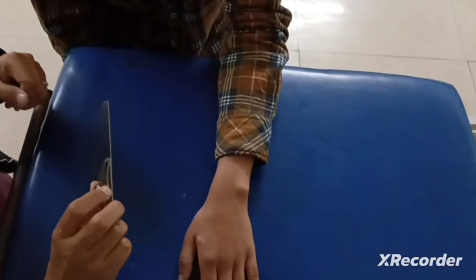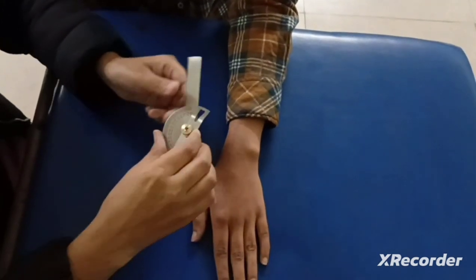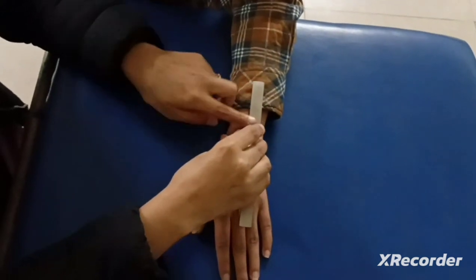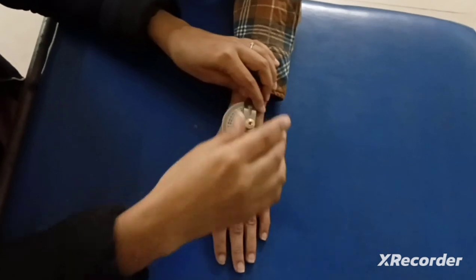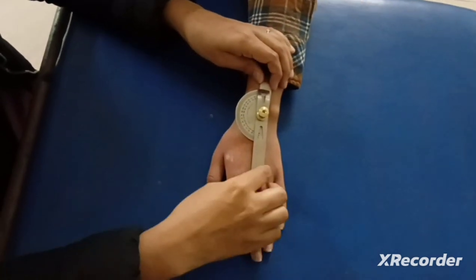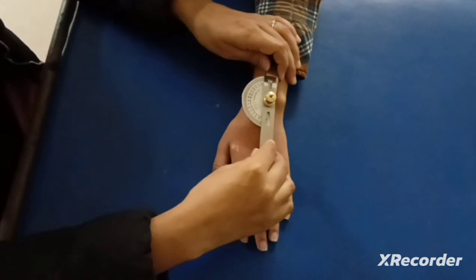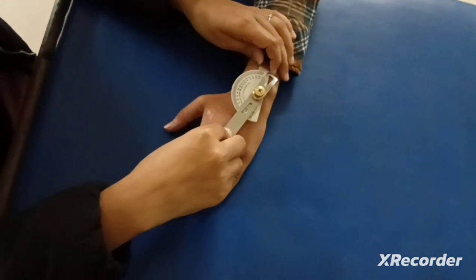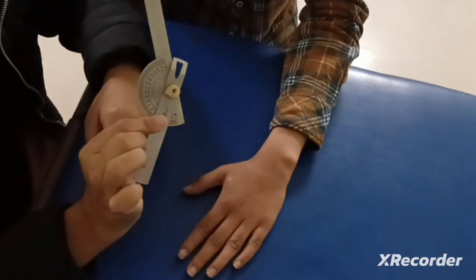Now the goniometer alignment for the wrist radial deviation. The fulcrum will be over the wrist, over the capitate. The fixed arm will be parallel to the midline of the forearm and the movable arm will be parallel to the midline of the third metacarpal. Now ask the patient to do the wrist radial deviation. So this is the goniometry of the wrist radial deviation.